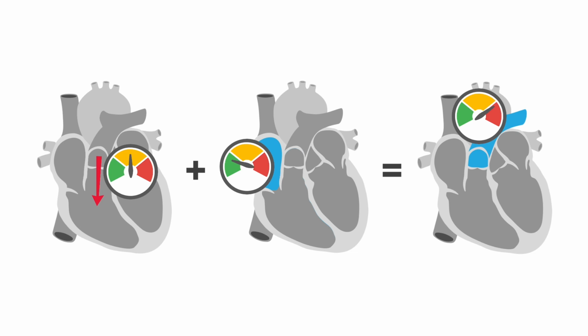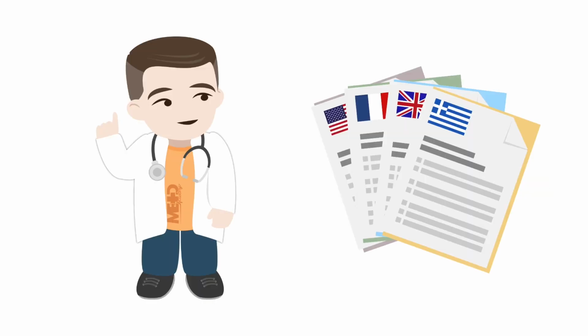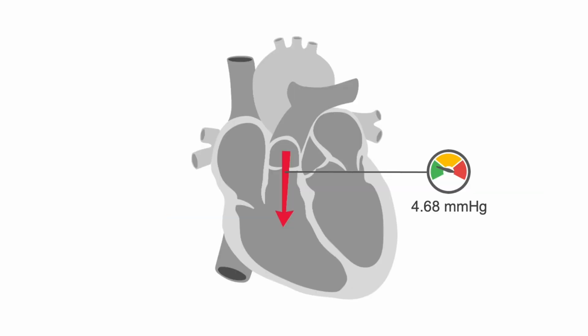Although this measurement is not widely used in normal practice, you may need to know how to calculate it in some very specific cases, for instance, in congenital heart disease. You can estimate the right atrial pressure by checking your national echocardiography guidelines for the correct estimation. Once you have, simply add this value to your measured pulmonary regurgitation end diastolic pressure and report the final result as PADP. Here's an example.